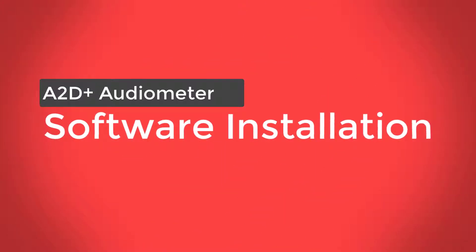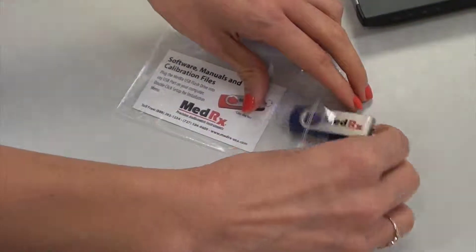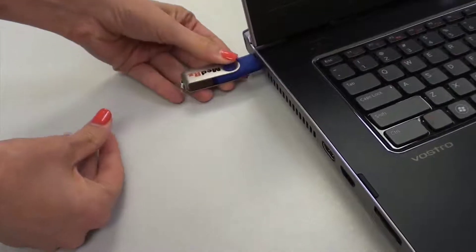To load the MedRex software, you will need the USB flash drive that came bundled with your audiometer. Insert the MedRex USB flash drive into any USB port on your computer.